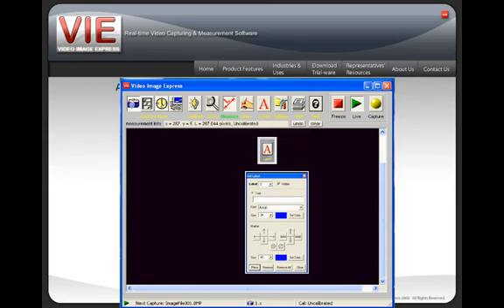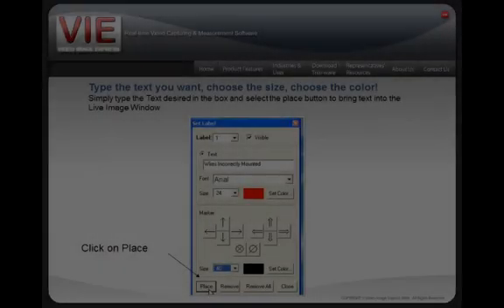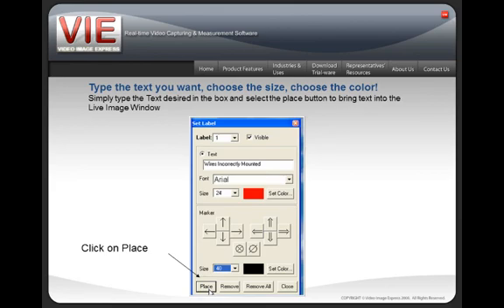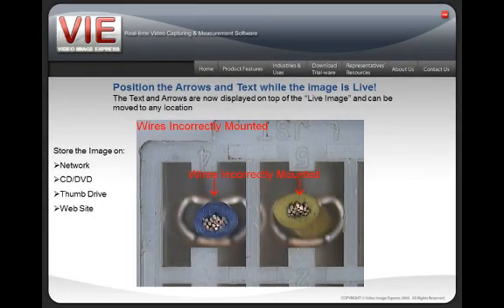Adding text is easy. Simply click on the label button and a label box will appear. You have up to 16 labels that you can put on any single image. When the label box appears, you can also pull down the font size or font color to change. Type the text you want in the box and click on the place button. This will place the text or arrows on the live image, and you can hold down the mouse and move the text or arrows to any position on the image. Then simply click capture.